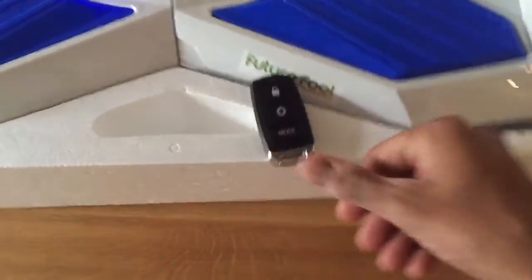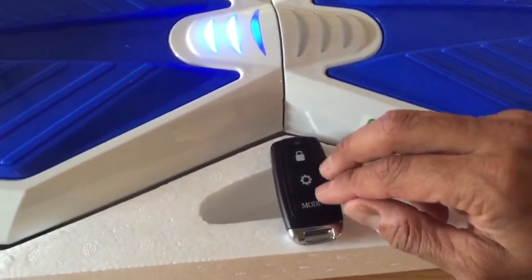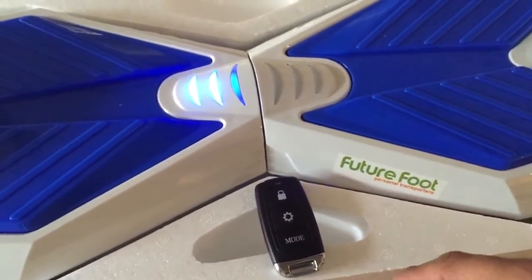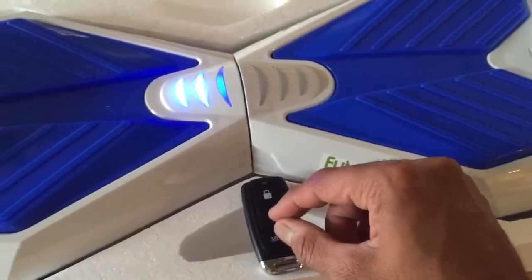On the remote control, these last two buttons you push at the same time, and this light is going to turn red and it's going to blink a few times, and that's when you know it's calibrated.